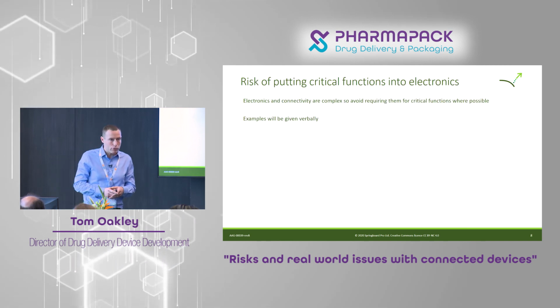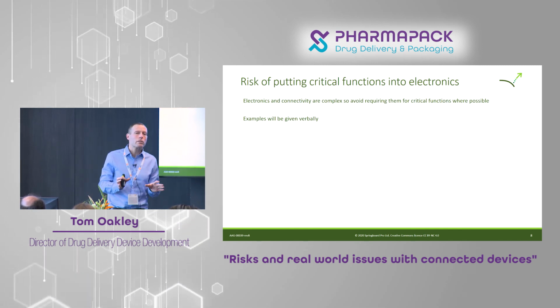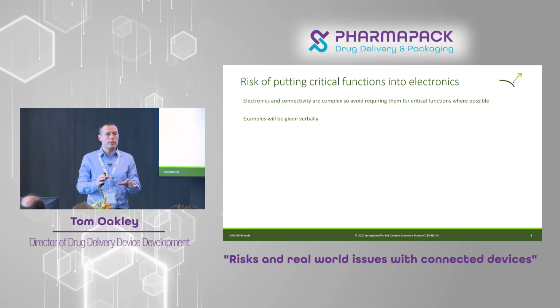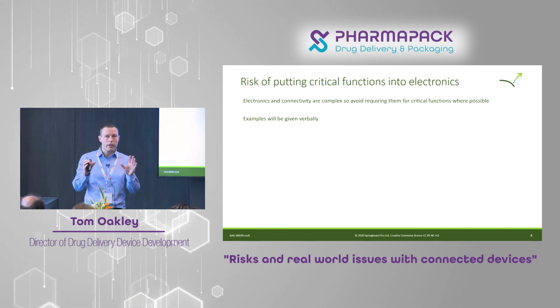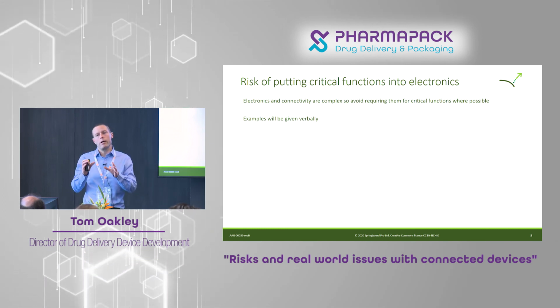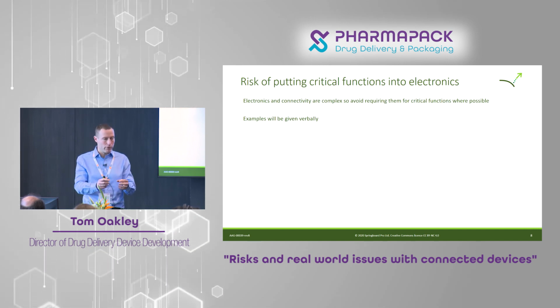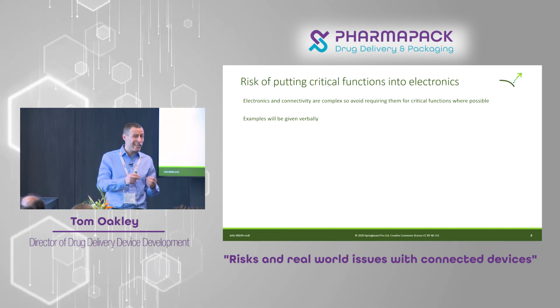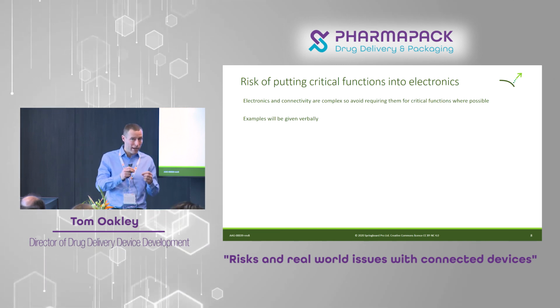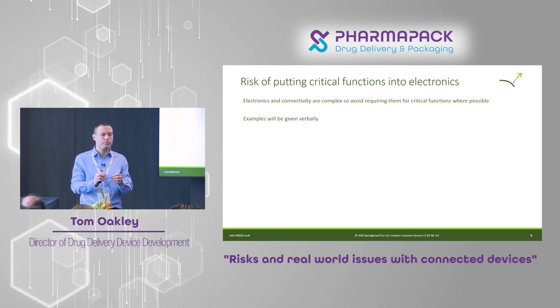The risk of putting critical functions into the electronics and the connectivity. I'll give you an example here. A few years ago, several insulin pens were released at the same time from different companies, and they were tackling one of the major problems with insulin pens. Just to give you an insight, if you're not familiar with them, with an insulin pen, you would typically dial a dose, which is a safety critical function.